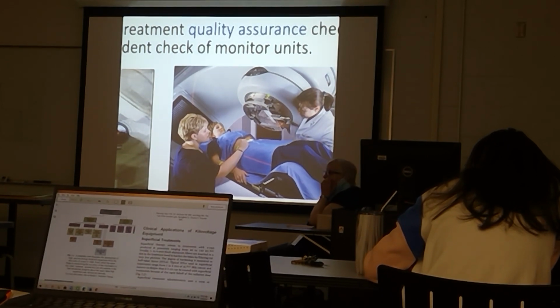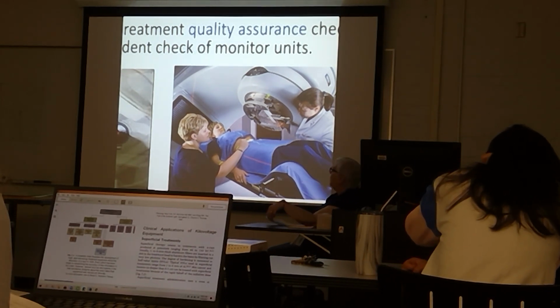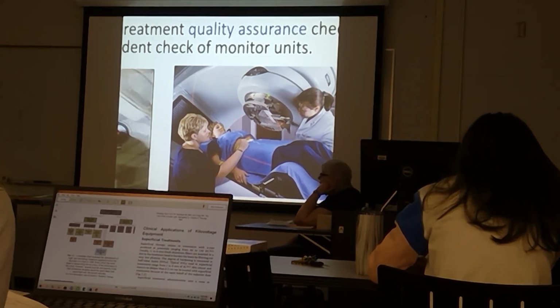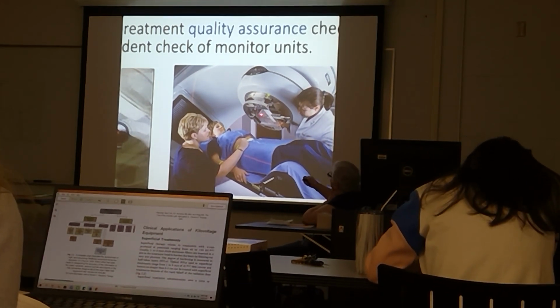Oh, that's the, well, I usually put that in for the electrons. Pardon? Put in a port film. No, that's called, you don't put a port film in there, you put a port film down here somewhere. She's putting in blocks. You see the tray?